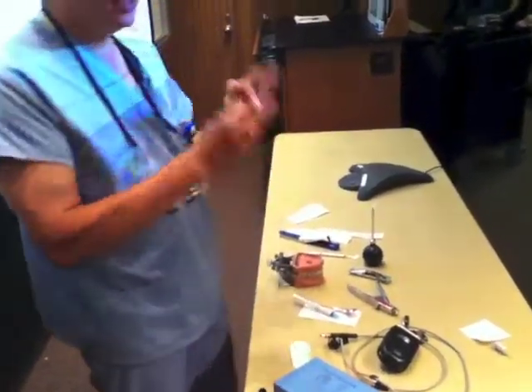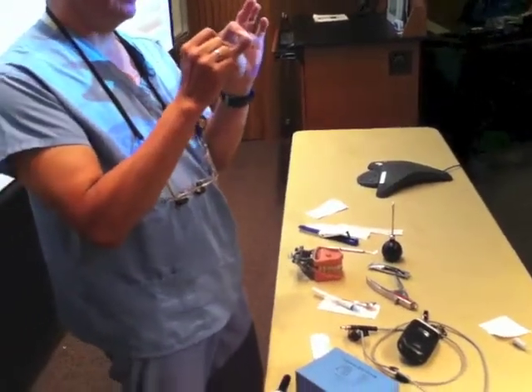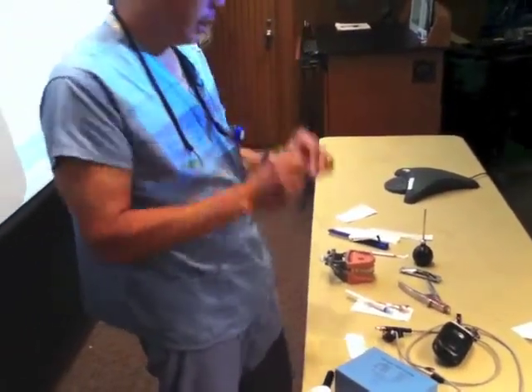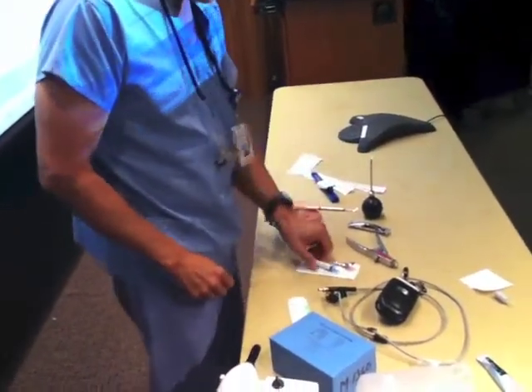This is where we do need two hands, because somebody's going to have to stabilize one end of the suture. So we've got the suture — we know where it is, we've got it laid off to the side.